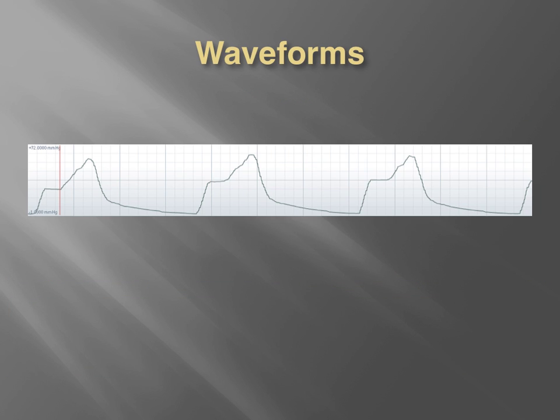Here's a great example of an abnormal waveform that may or may not be related to what we just discussed, with the patient either trying to override the ventilator due to lack of sedation or the fact that they're hypercarbic and their body is becoming more and more stressed because of the hypercarbia and trying to override what we're doing for them, which is not enough.